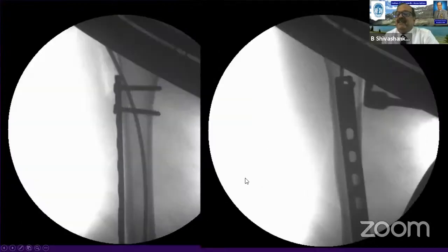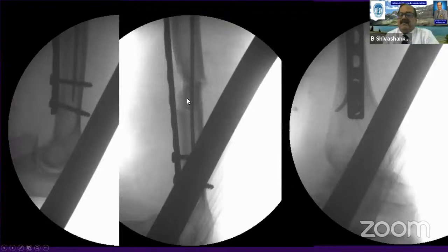As I said earlier, an orthopedic surgeon modifies the technique in the first instance. For a transverse fracture, I pass a TENS. I open from the shoulder first. This is from the anterior aspect where I have taken the incision, and the entry is somewhere here. So I pass the TENS, then get the reduction, then I apply the plate. That makes my life very easy because the reduction will be absolutely perfect. I can remove the TENS at the end of the surgery, or I can retain them because they give some additional support. And anyway, it is not going to trouble the shoulder, which Sergio is very fanatic about. I am putting it from the anterior aspect just proximal to the plate. Anything?